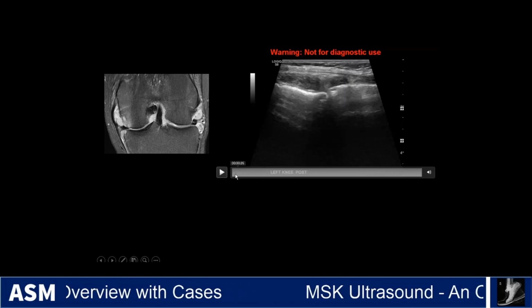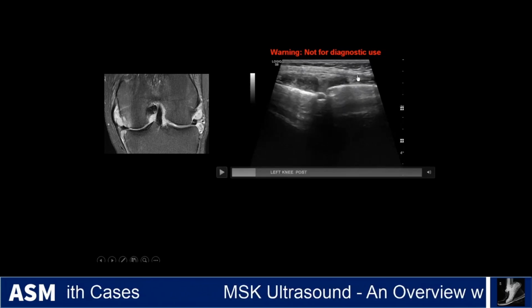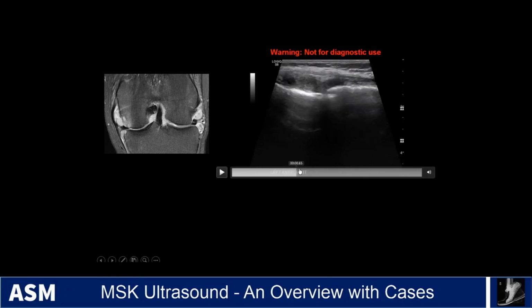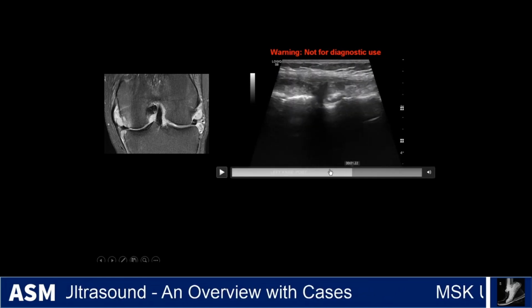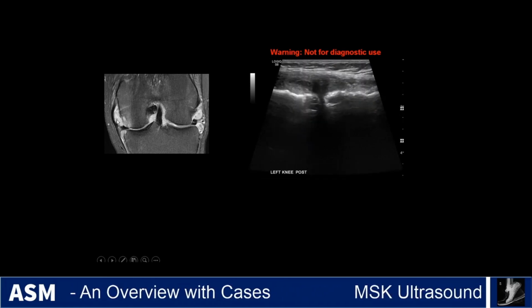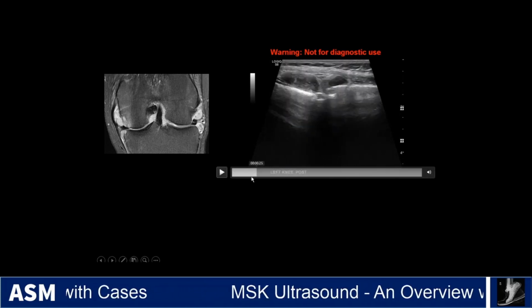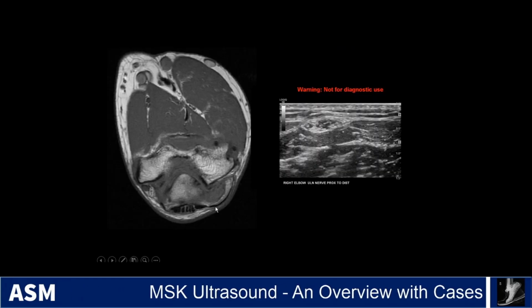And then just showing you the cine here as we're coming through, you see the synovial tissue, ligament on the top. This is the MCL being buckled out by this synovial proliferation. And when you look at the bone, you can see these erosions in the bone, these marginal erosions due to the synovitis. And as you come around, you see that it's actually on both sides. I didn't scroll all the way through, but you can sort of see that there's erosions on both sides here. So nice case of active synovitis with bone destruction occurring in this patient with rheumatoid arthritis.